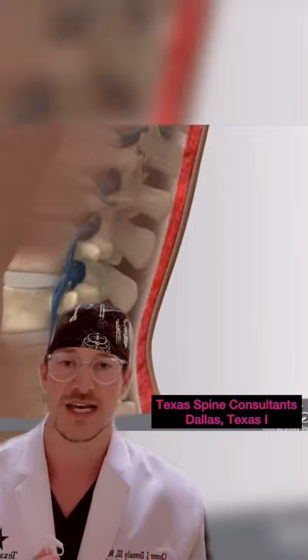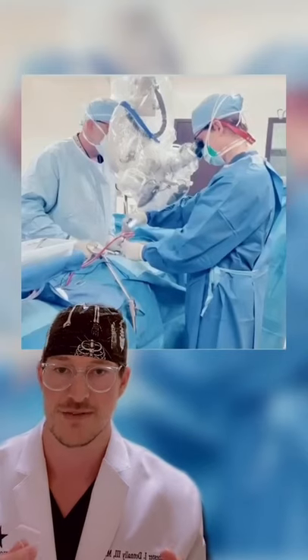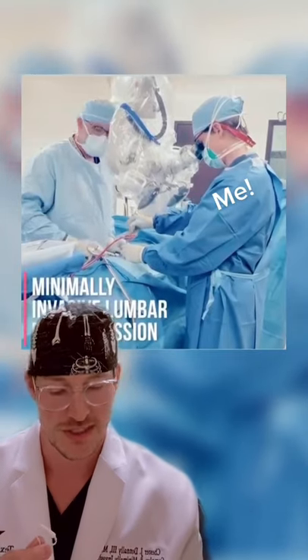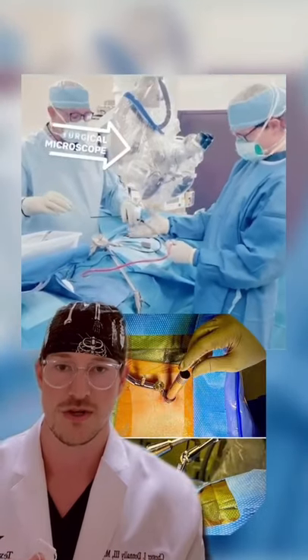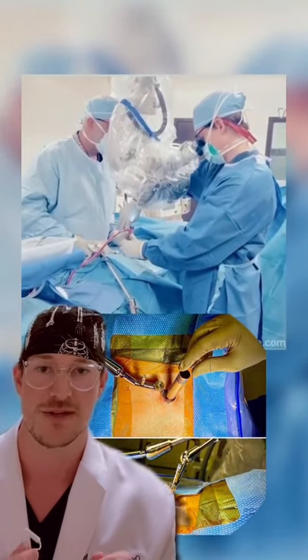An incision the size of a quarter is made. Probes are placed down there, ranging from the size of a pen to the size of a large sharpie. From then, a microscope is used to look down this tube. You'll be able to see the disc herniation, the bone spurs, the nerve roots. You use various tools to take out this disc herniation in a minimally invasive fashion.